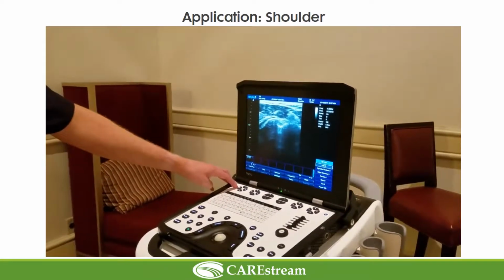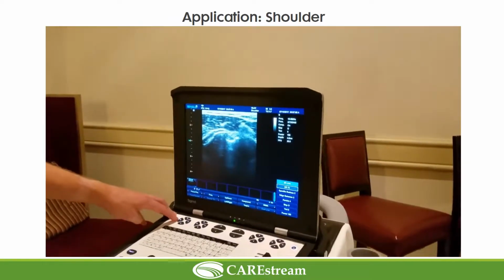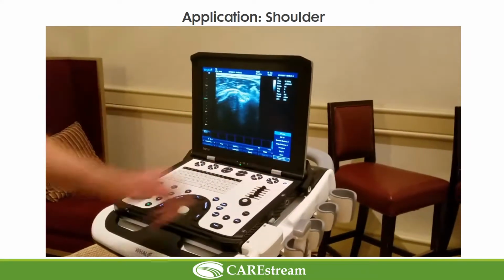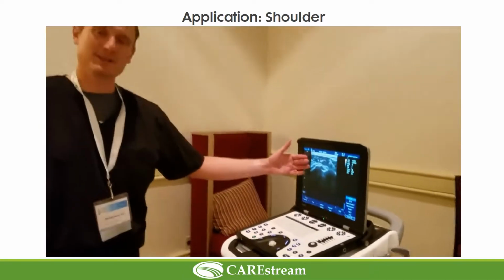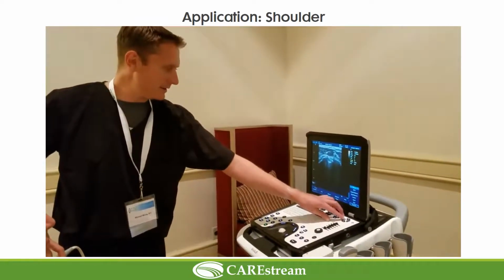If you look at this image and you can't see much contrast, one thing you may want to do is adjust the acoustic power. Soft key. So we come down to acoustic power at 100%. What acoustic power is, that's the amount of whiteness that the machine generates. So if I decrease our acoustic power, it's going to be less harsh to the eyes.